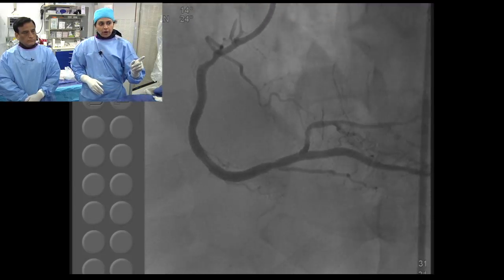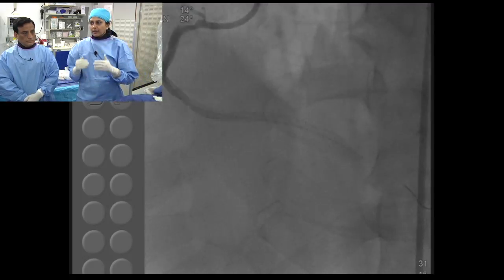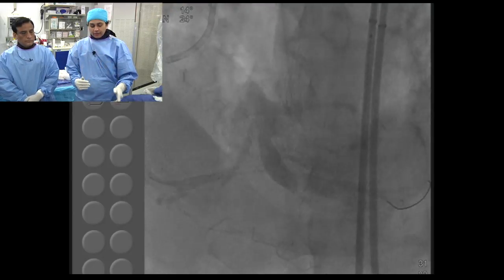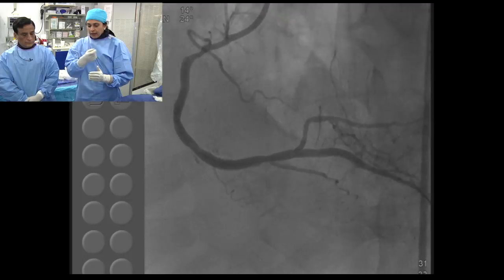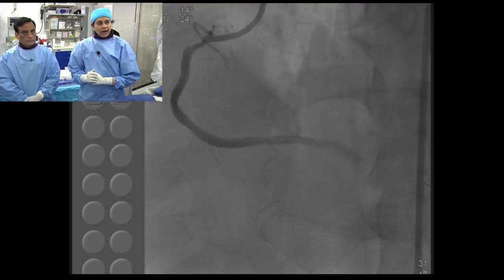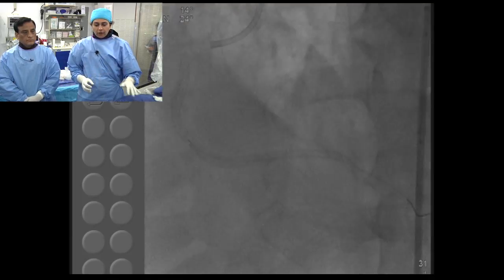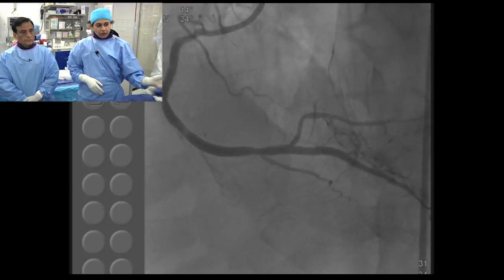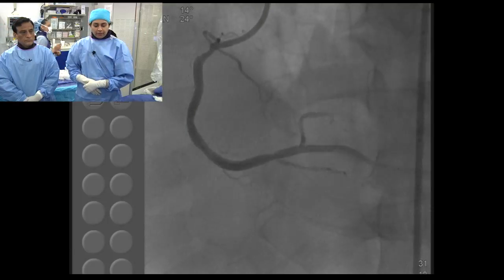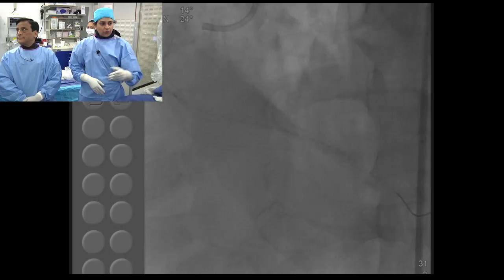And the other most important technique that we showed was how you take this Viper wire out of the body, the KISS technique, which we saw. The Corsair and the FineCross have to be together. Get your Viper wire out so that your 2 guides are not getting sucked into the vessel. Once that wire is out, then with the FineCross, you get into your PDA with any over-the-wire antegrade, you balloon dilate like we showed here.